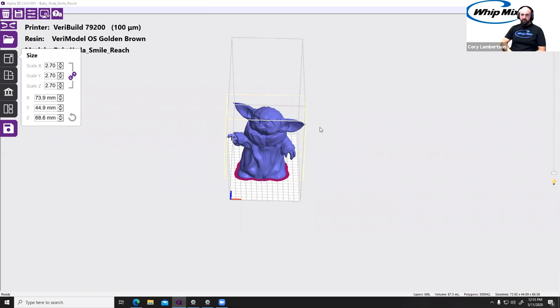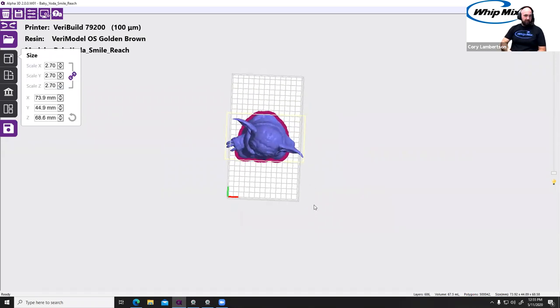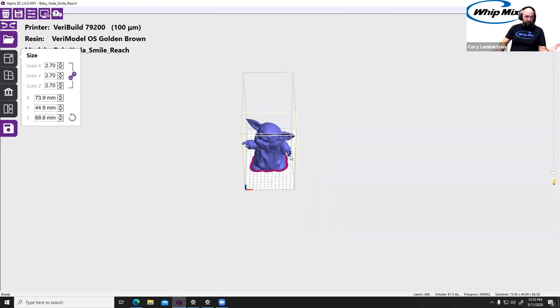So you can see, for outside dentistry, you have an application for this, where you can scale it. If you're printing for an inside dentistry application, the scaling option is not something you want to do, unless you want to create a massive die as a sample that you have at your desk, or just a large scale denture for a sample. Once again, just for coolness.